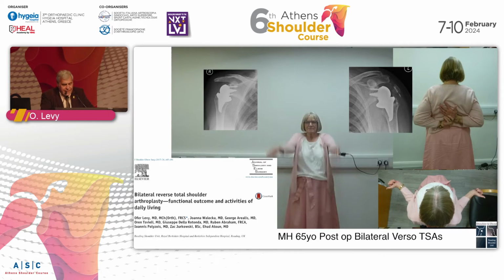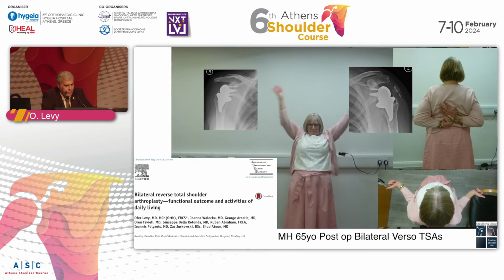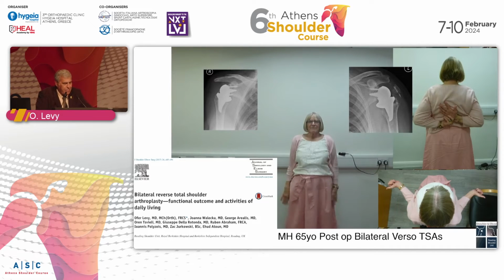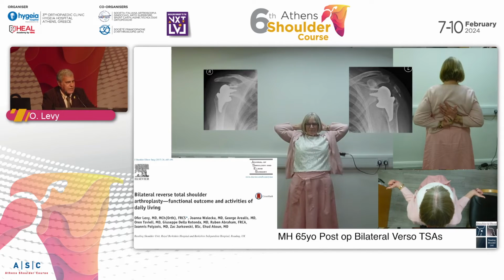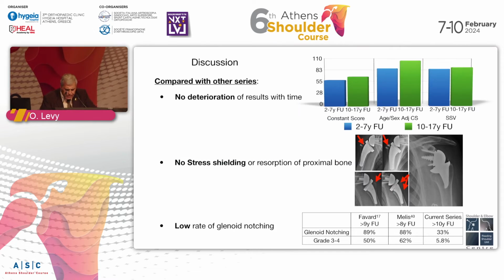So we don't see this problem with a Verso, and we had a paper that we published some years ago about bilateral reverse shoulder replacement with a Verso, and you can see in all these patients, their rotational movements are really good, and part of the secret is the fact that they have impingement-free movement because of the shape of the design of the implant.